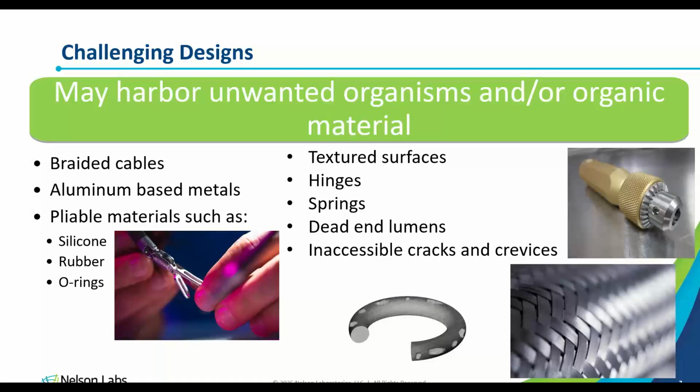I'm designing a handheld surgical instrument. Can I expect ball bearings within the handle to pass a cleaning validation?